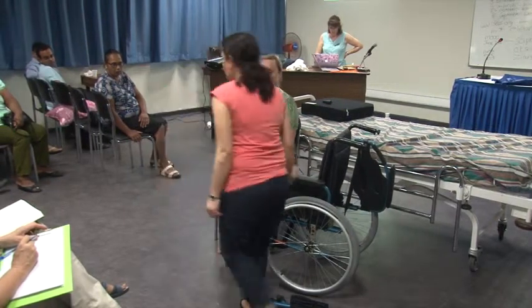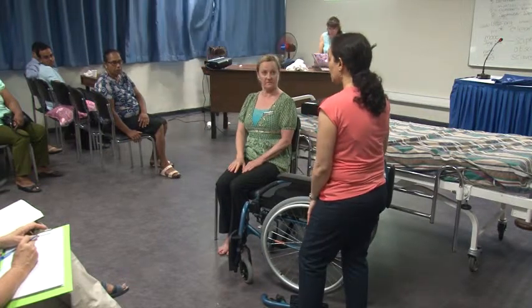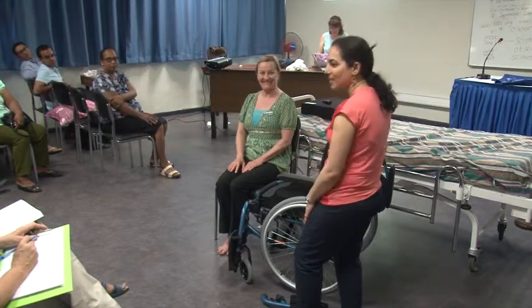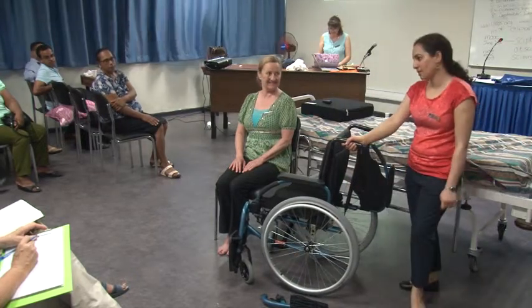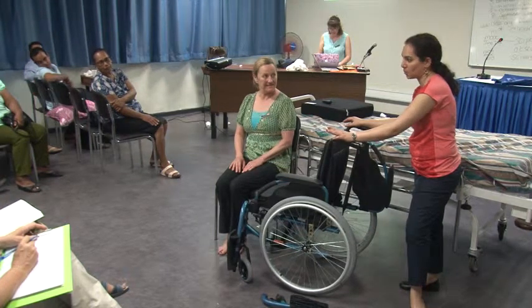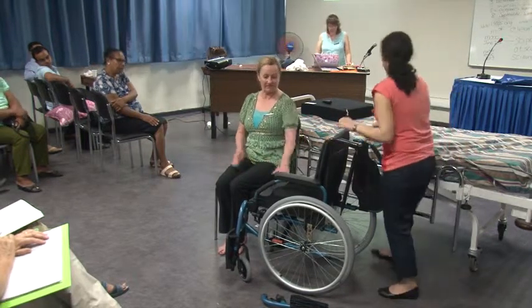Right. What is missing in this? What equipment is missing? Can you think? Slide board. Cushion. A cushion. A cushion is missing. You cannot put a person in a wheelchair without a pressure cushion. Putting a person without a pressure cushion means you are asking for pressure sores, you're inviting pressure sores. Okay? So a wheelchair is incomplete without a cushion.